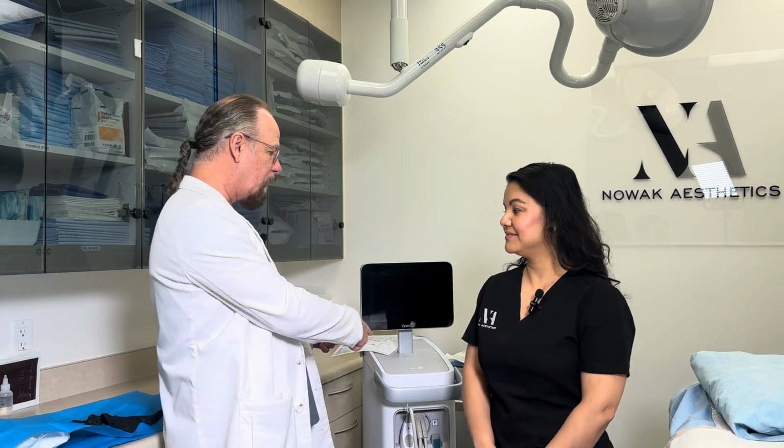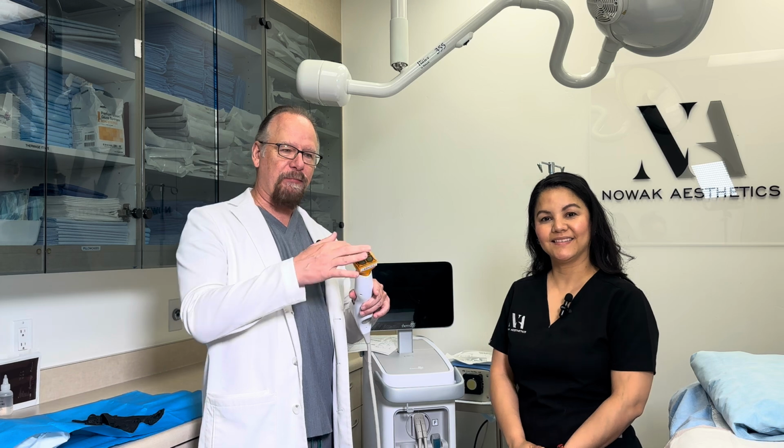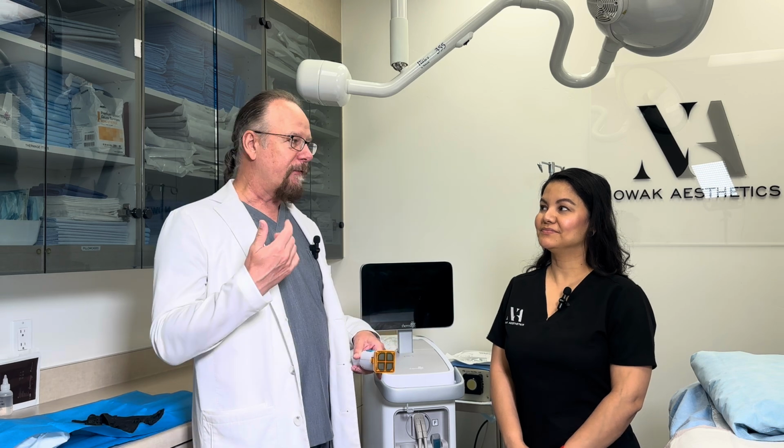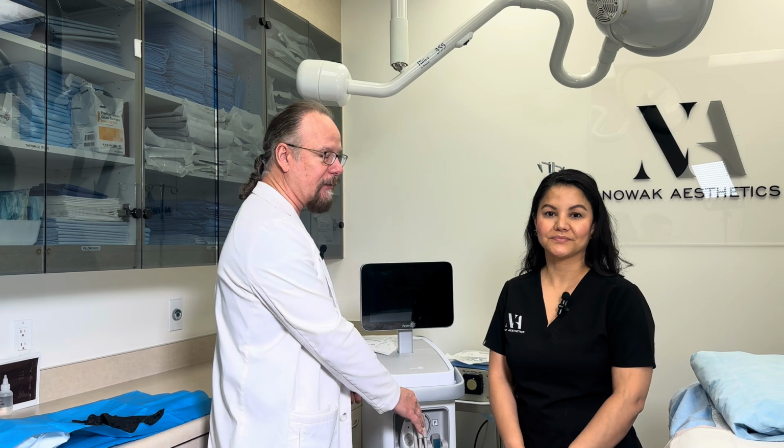Now, the other thing that happens with that awake lipo, not only are they awake, but we are bringing in this machine. This is Thermage, and this is a skin tightening treatment. It's radio frequency. This tip right here is going to cover that area of the skin. We're going to treat that whole abdomen, shrink and tighten the skin. We don't have a study to prove that it tightens muscles, but we see on a consistent basis that it helps to tighten it. Of course, you heard about that M-Sculpt, how we can combine that to get people the better results.